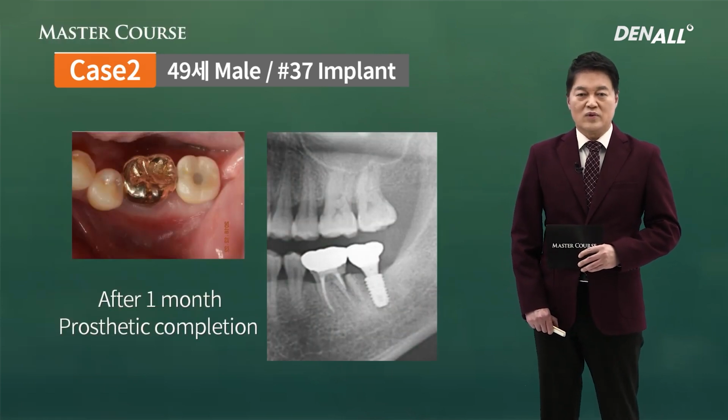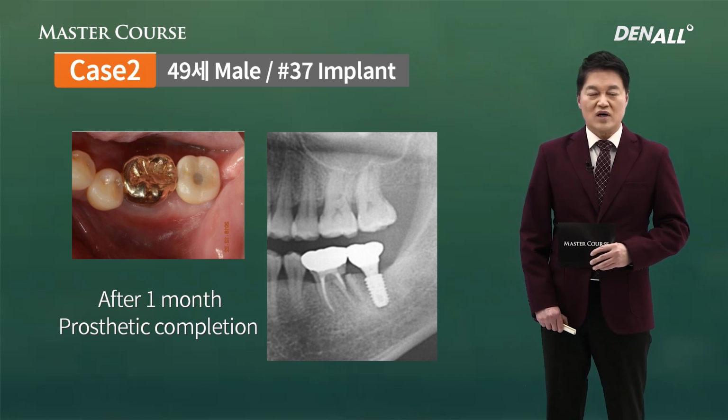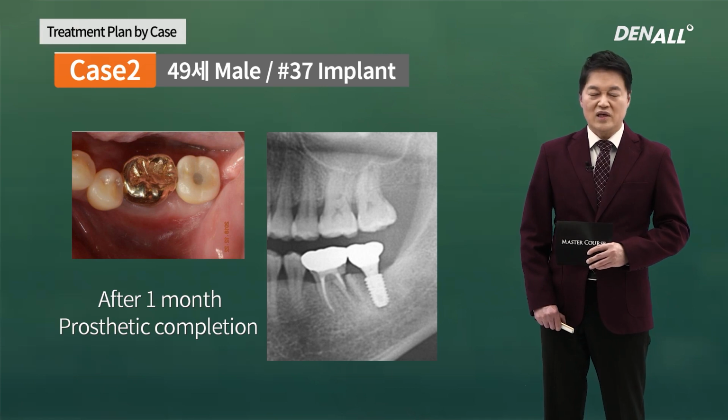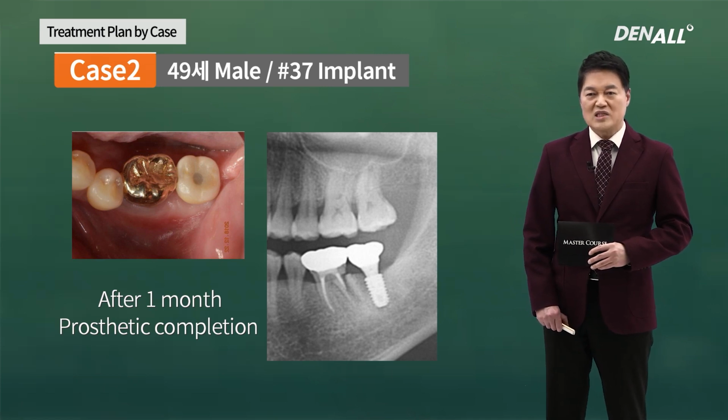After 1 month, I took an impression and the prosthesis was delivered. You can see that the implant was placed in the desired position and direction. So the implant hole position is at the center.